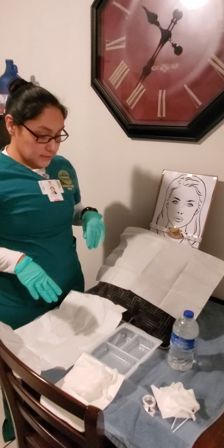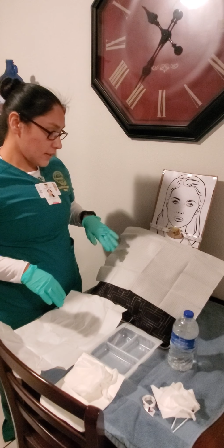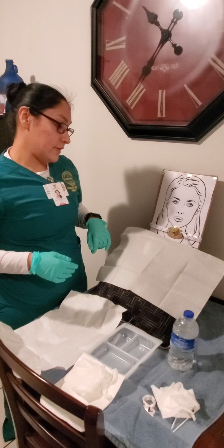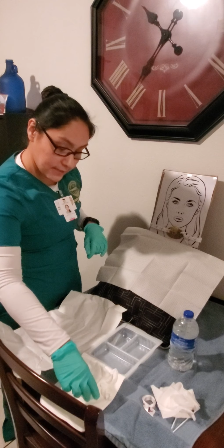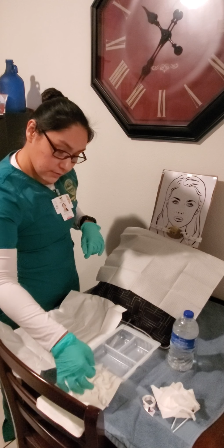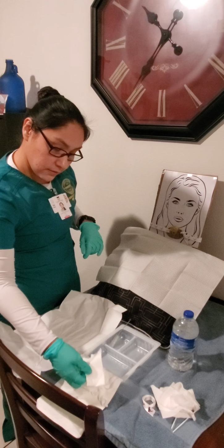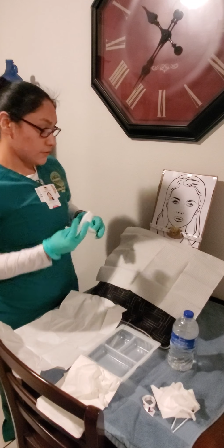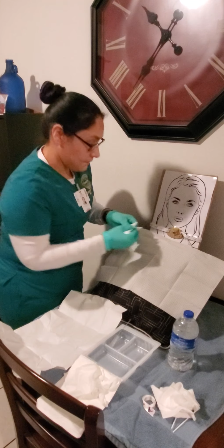Okay, so once that's done, and once it's dry, you can go ahead and proceed to apply the new dressing, which is the fenestrated gauze, which would be this one right here. So we're going to go ahead and apply that.